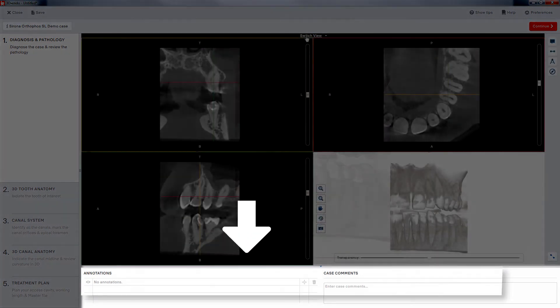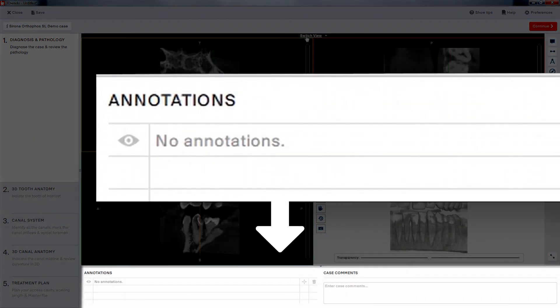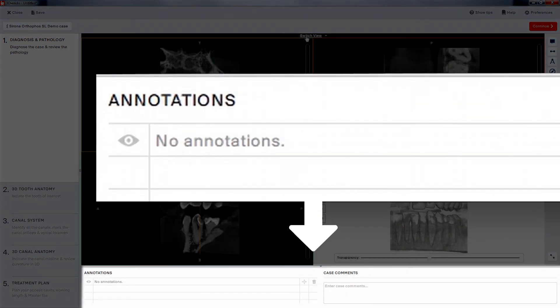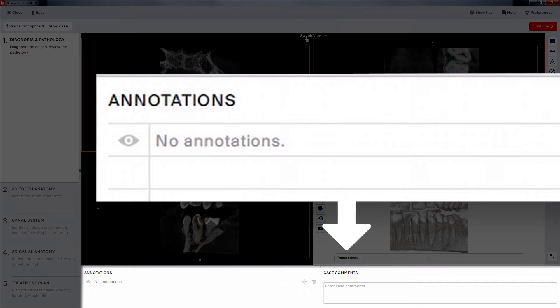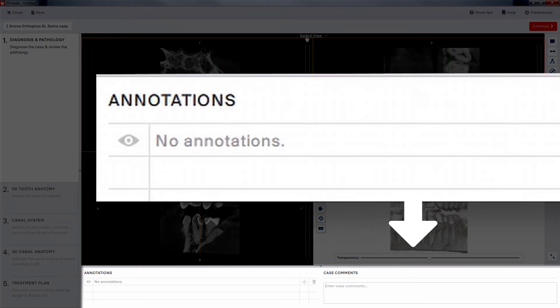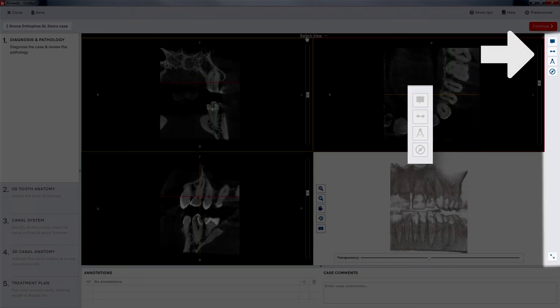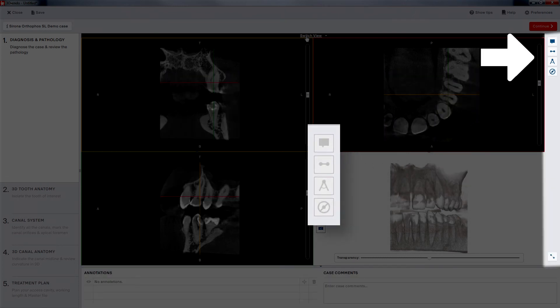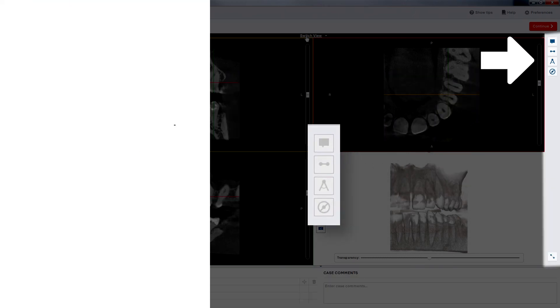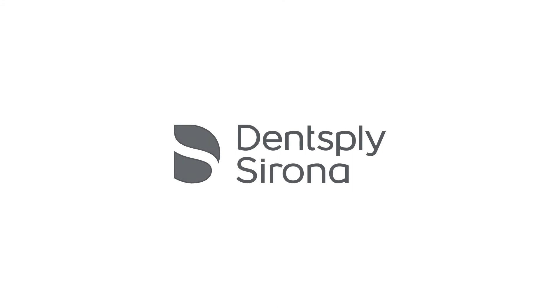At the bottom of the 3D Endo user interface is the section for annotations and comments. Notes can be made in the axial, multi-screen, and OPG view. The controls are on the far right-hand side of the screen.